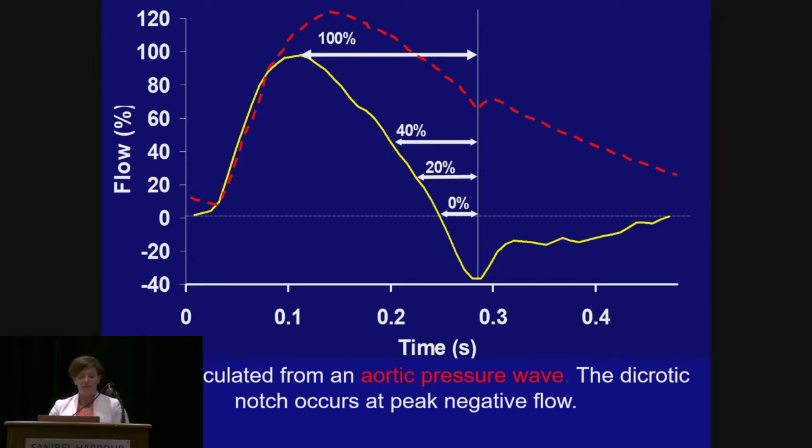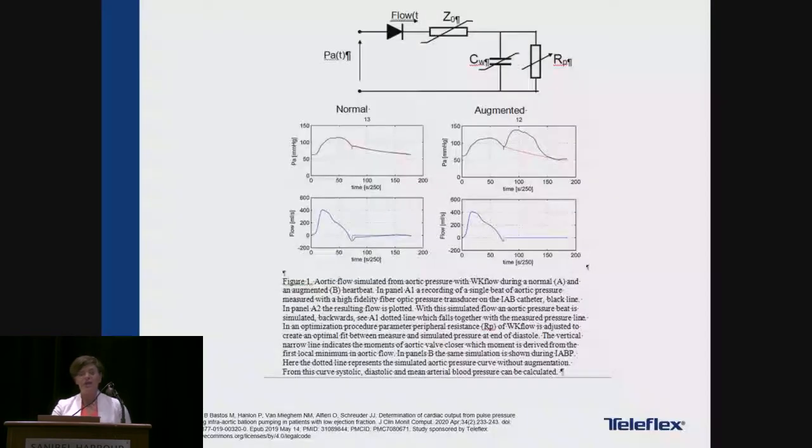Now, this is still only showing the work in the time domain. Now, when calibrating the flow wave to volume, there are situations that can cause an abnormality in the waveform, and counterpulsation or phasic support, most commonly from a balloon pump, causes such abnormalities. However, other devices could also impact the waveform's morphology.